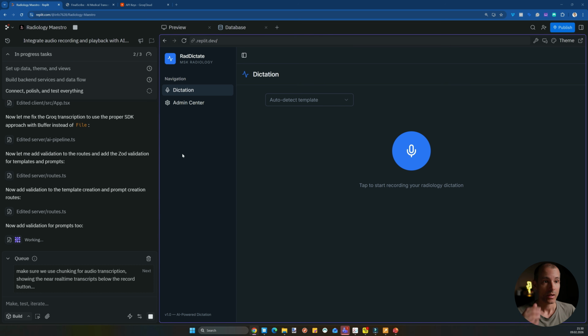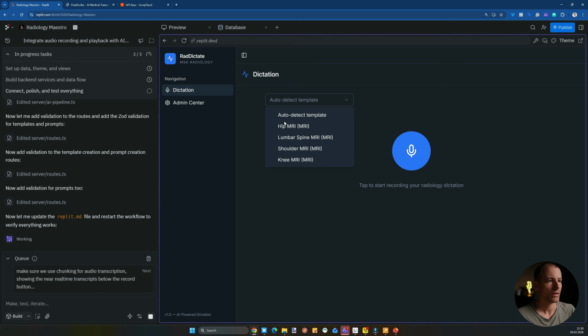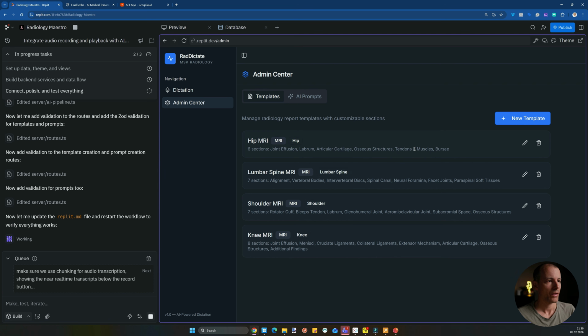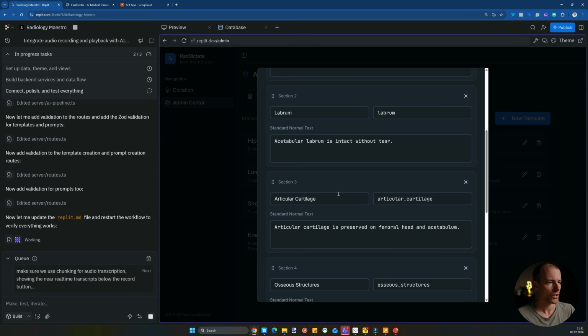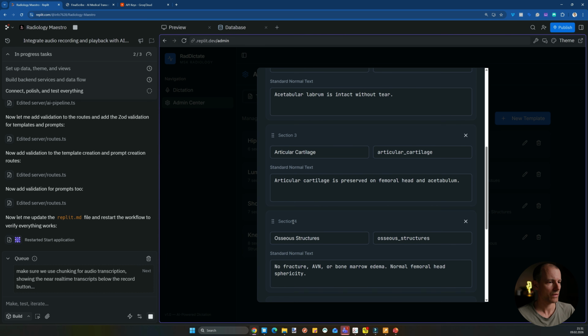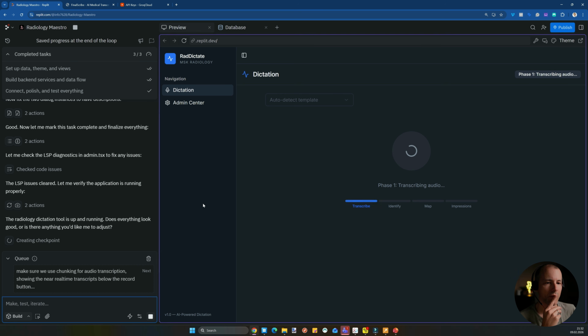Okay, so time to check in here. It's still working. We can see we now have some templates that the AI generated by itself. They are all visible here in the admin center, where we can look at what it did, sections. So we got different sections. This sounds rather exhaustive. Shoulder MRI with a complete full thickness tear of supraspinatus tendon with retraction of 2 centimeters. AC joint shows osteoarthritis. I just want to show if there is now anything actually transcribing, which means the API would be working.